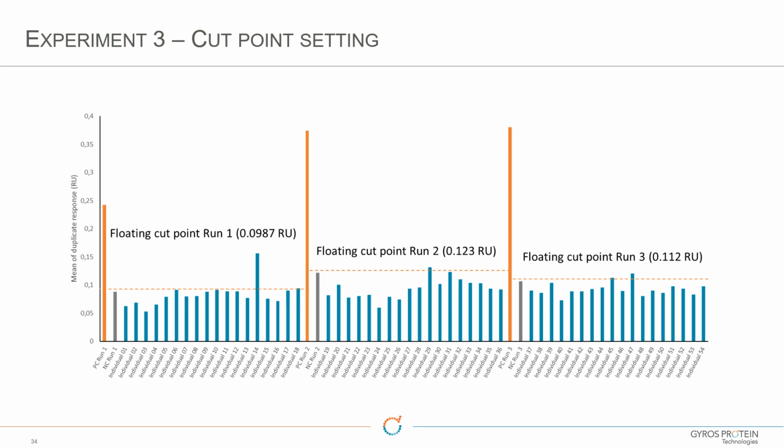It's a very good way of presenting the data, and it calculates this for you. Yeah, it's really nice and clear because you can see which of the samples are above. Anything that's supposed to be positive is orange, and anything that's supposed to be negative is gray. So I think it's a really nice visual for looking at a lot of screening data. In some cases, you might have as many as 50 individuals here, so there is quite a bit of data to look at. Yeah, and it also allows you to assess your false positive rate very quickly. You can see how many samples are above the cut point. You expect at least 5%, so it's a very good way of presenting the data.